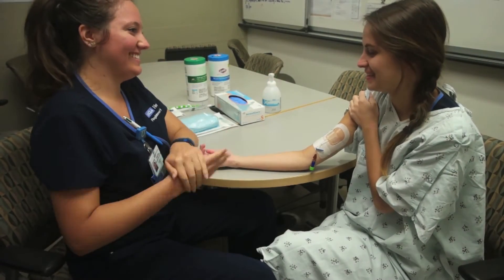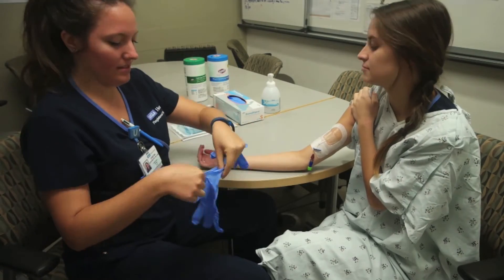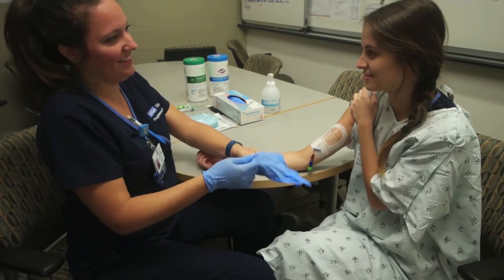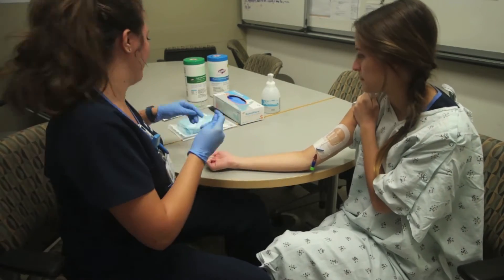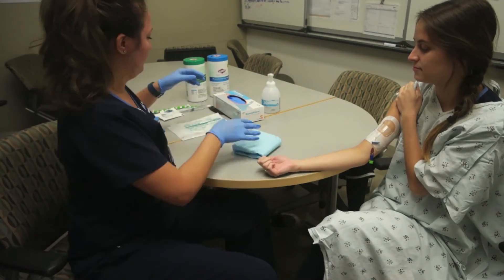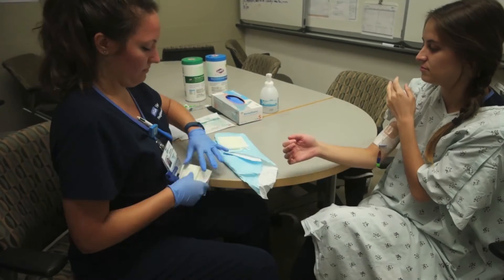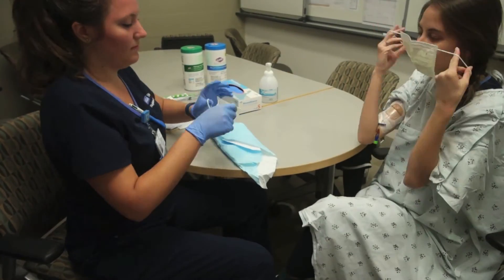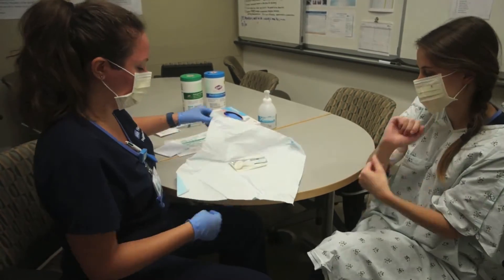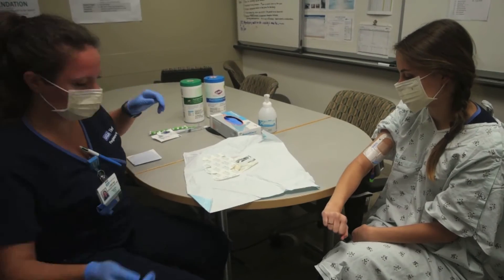First, perform hand hygiene and don clean gloves. If you're already wearing gloves related to isolation or other procedures, remove them, perform hand hygiene again, and don new gloves. Next, apply a mask to the patient or ask them to turn their head away from the catheter site. Then you don a mask for yourself as well. Then you open your supplies on a clean, stable work surface, maintaining their sterility.